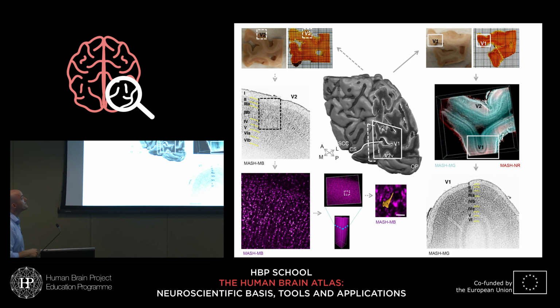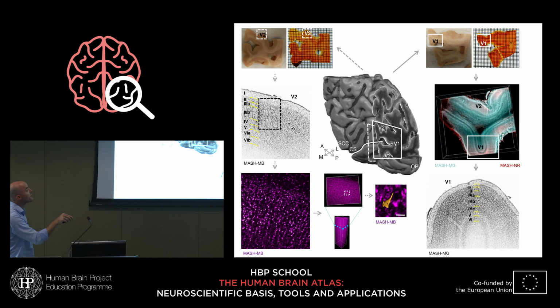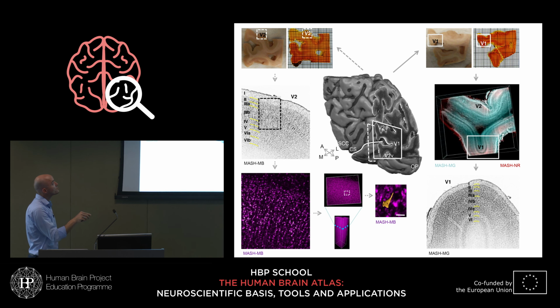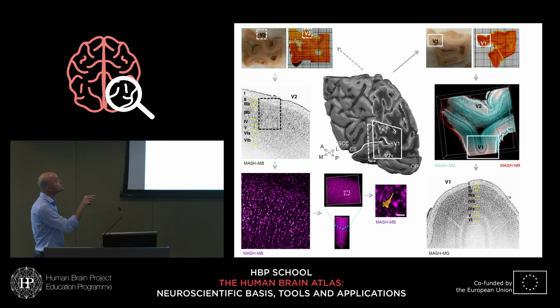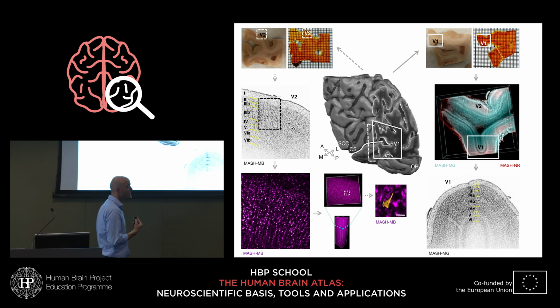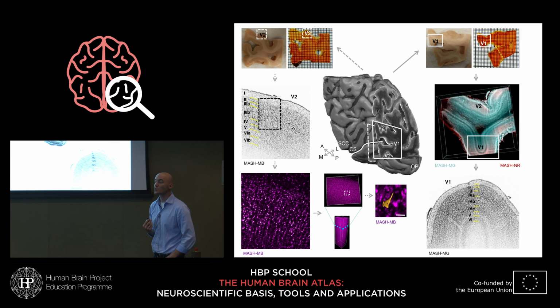If you go to the other, the back tissue block, here again it is after clearing, and we focused a little bit on V2. We did a magnification where once again we have sufficient contrast to classify all cortical layers and even the sublayers. So we can put this next to a classic cytoarchitectonic atlas, where we're capable of recognizing all of these cells.